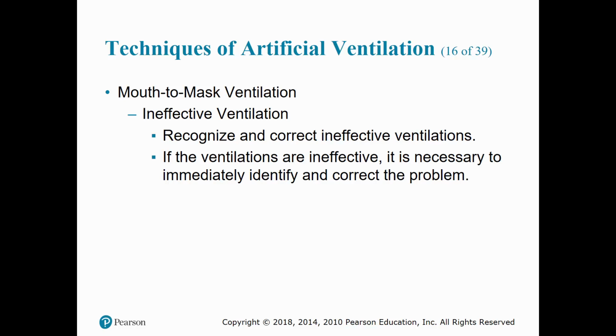Readjust your mask and make sure that there are no seal leaks between the face and the mask. Attempt administering a greater tidal volume, and if that still does not work, consider inserting an oropharyngeal or nasopharyngeal airway to assist in maintaining an open airway.